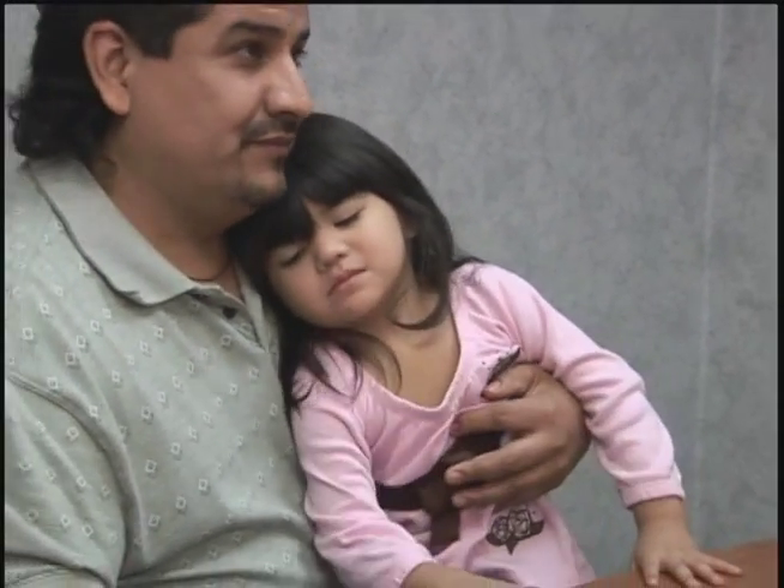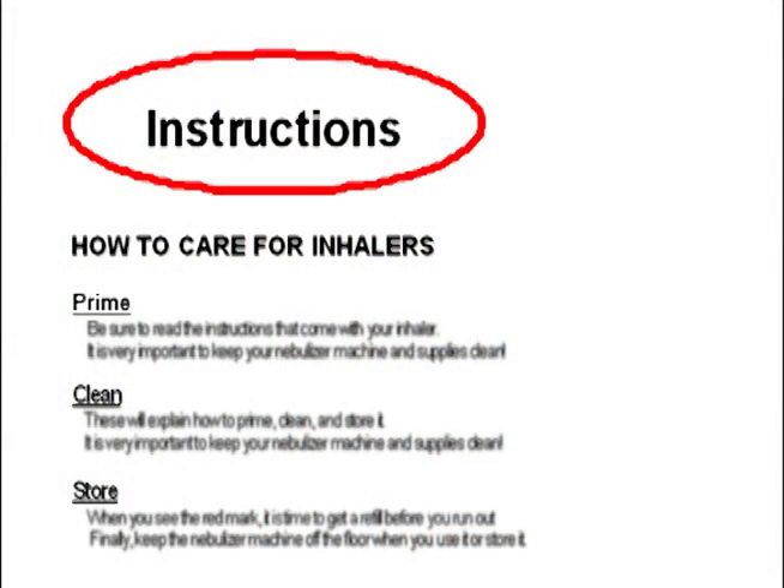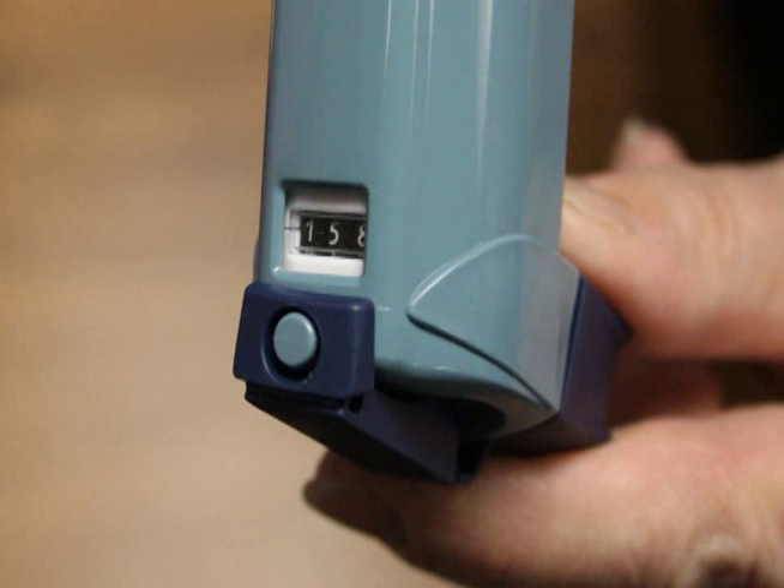When you use an MDI with a holding chamber, if a second puff is needed, wait at least one minute between each puff. Be sure to read the instructions that come with your metered dose inhaler, which will explain how to prime, clean, and store it.